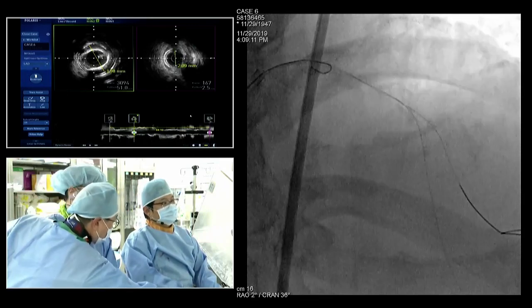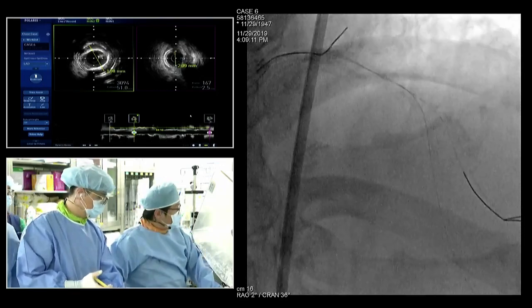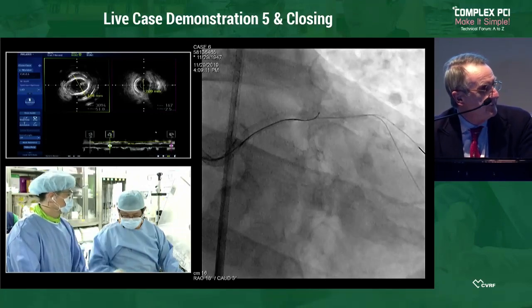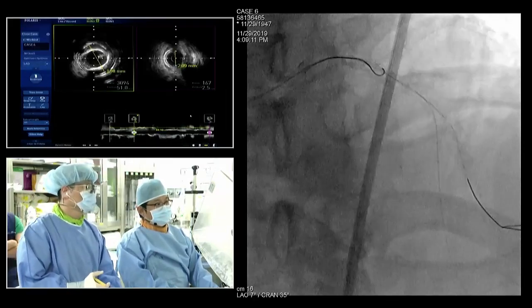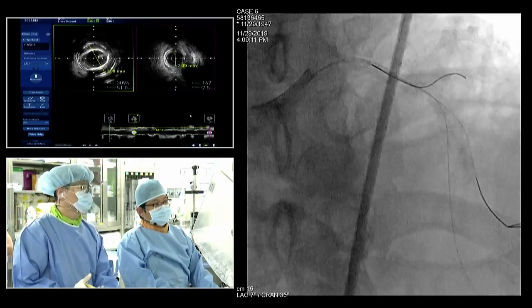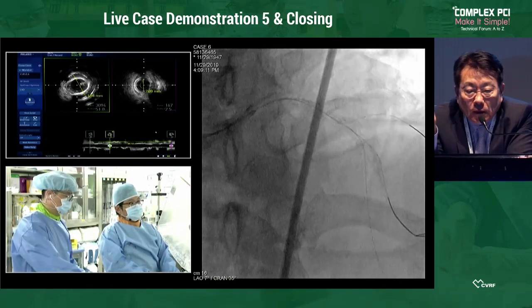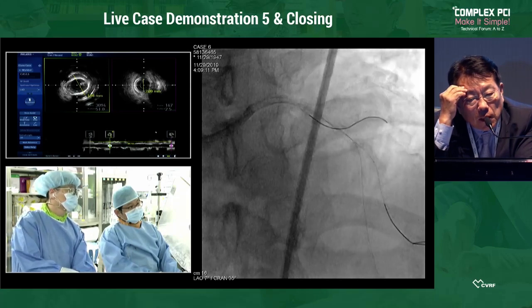If you fail the wiring, you do better to use a supporting device, Corsair or a microcatheter. Retrospectively, when you have these long calcified lesions, I will prefer to do rotablation because you get a little bit less side branch compromise. Yes, I agree. Good. Perfect. In the dissected main branch, sometimes we have to cross the wire of side branches to prevent problems. However, it's very good luck, good end.